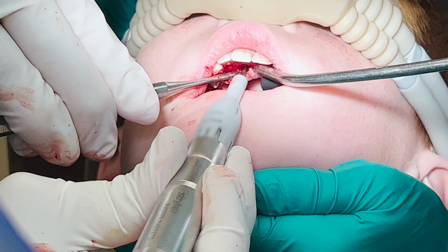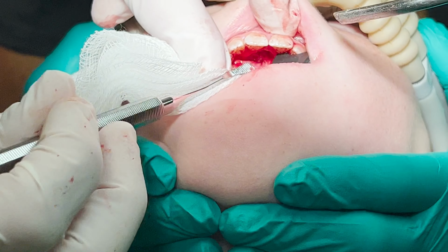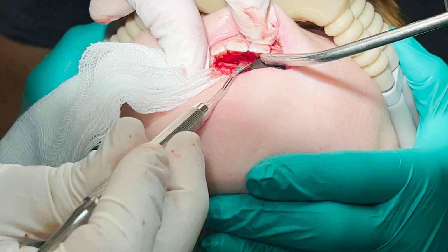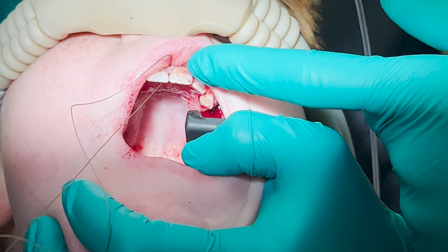Now that the supernumerary tooth is out, I'm going to use the burr to smooth off the edges and a bone file as well. And then once I'm happy, I'm going to irrigate it very thoroughly. Finally, I'm going to close this with interproximal sutures.